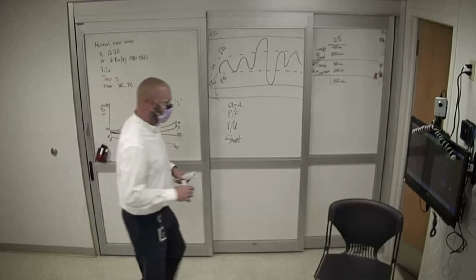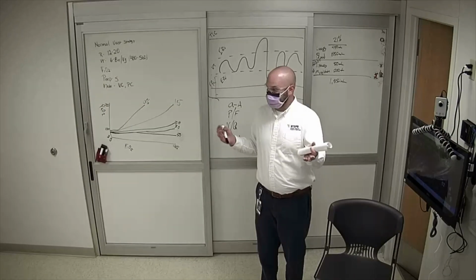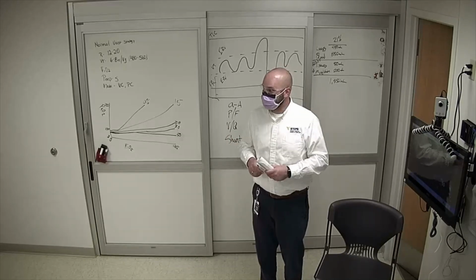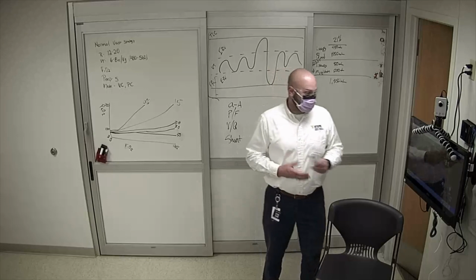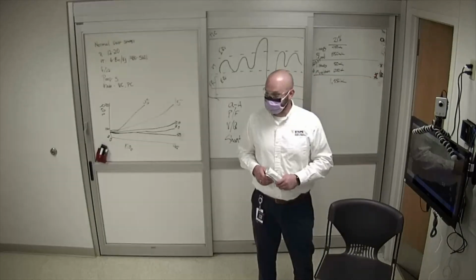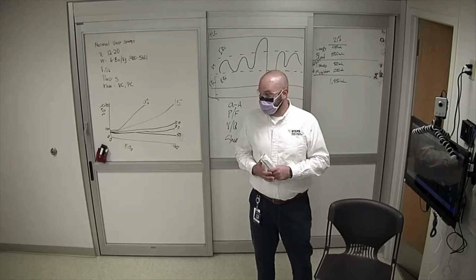And I'm actually okay with it, right? Obviously, we know we did this to Stanley, so we know this is not what's going to fix him. But if you walked in and you saw your patient's O2 sats were 80%, I hope you'd run over and hit the O2 breath button while you were investigating something, right? Because who knows what's causing this? But regardless, he needs 100% oxygen.